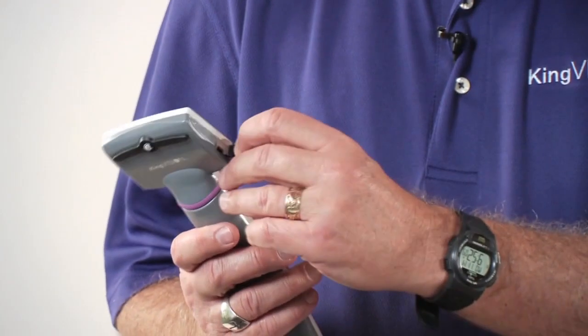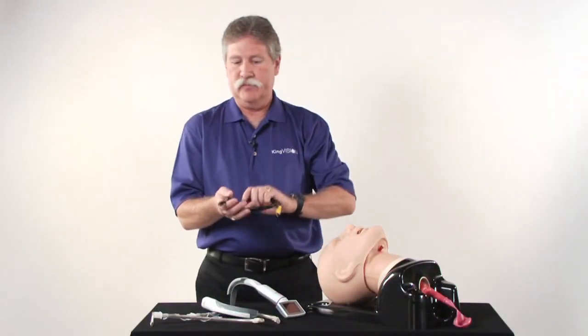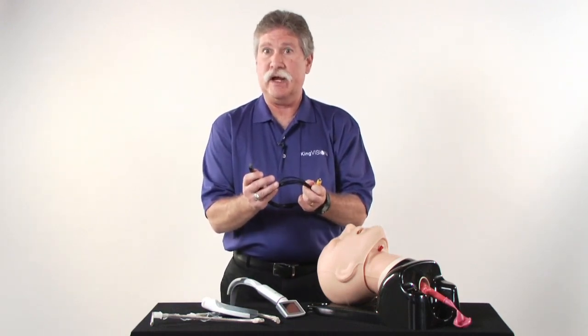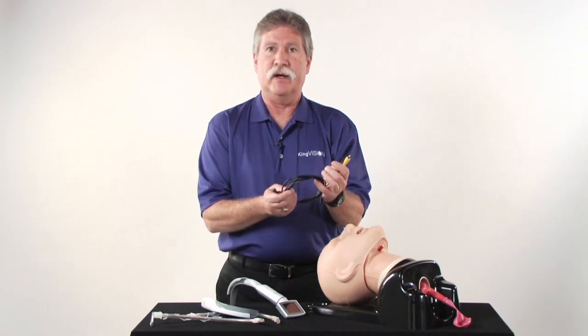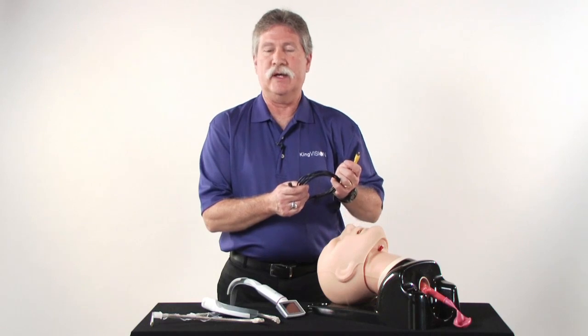There is also a video out port that requires a specialized cable to connect. It's a mini USB, although non-standard. At the other end, it's a standard RCA plug to input into any video capture or external display.